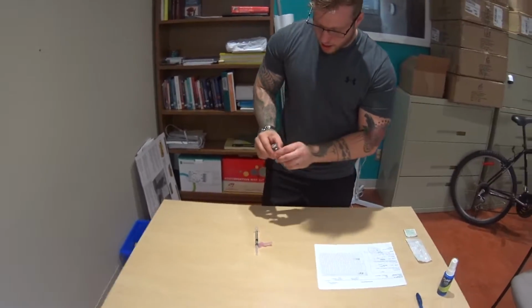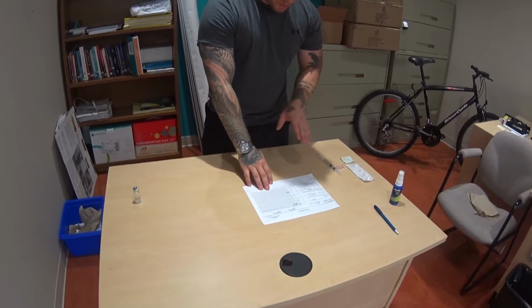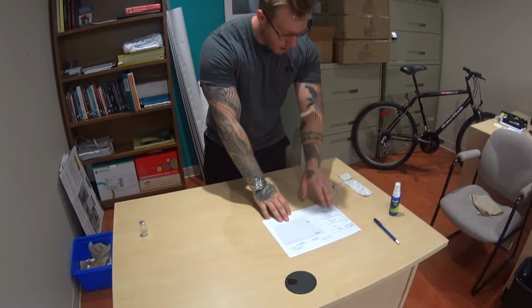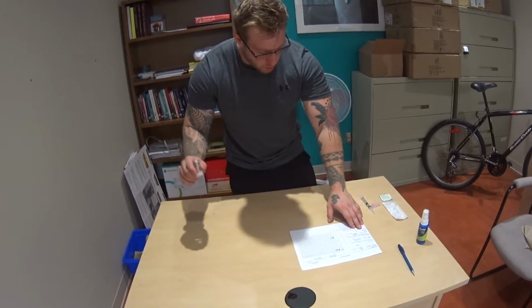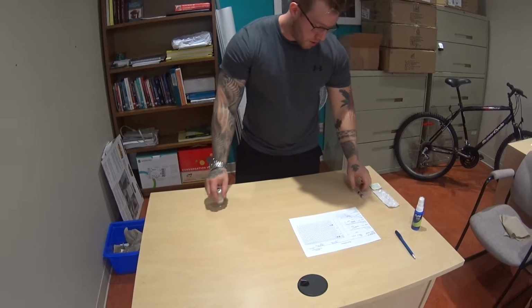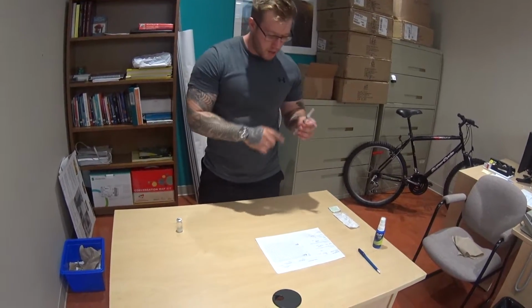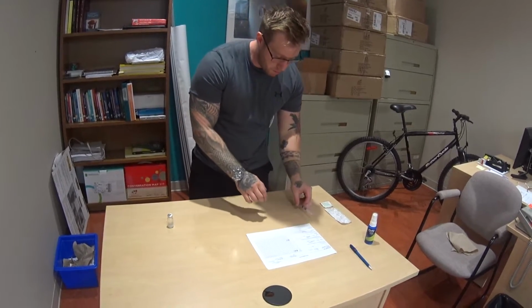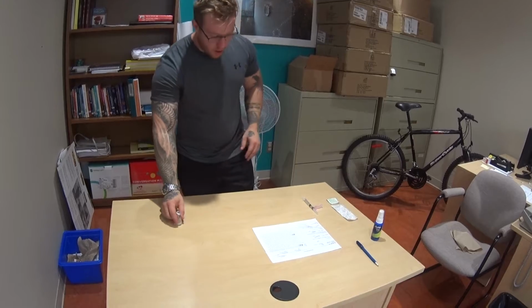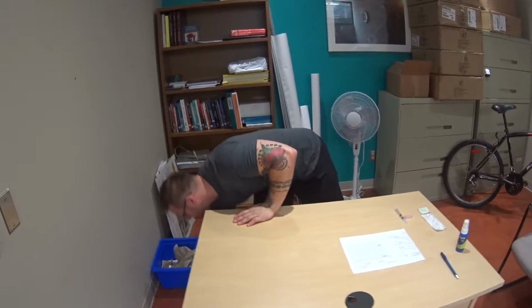So that would be our needle. I'm going to perform my third check right now. We know we have Joe Milton, haloperidol, haldol. And we do have 2.5 milligrams or 0.5 milliliters in the syringe, which is the right dosage. Awesome. So we have everything we need. I can put this away now because our third check's been completed, so I'll lock it away.